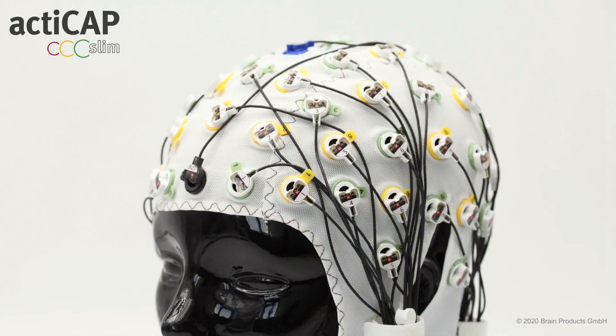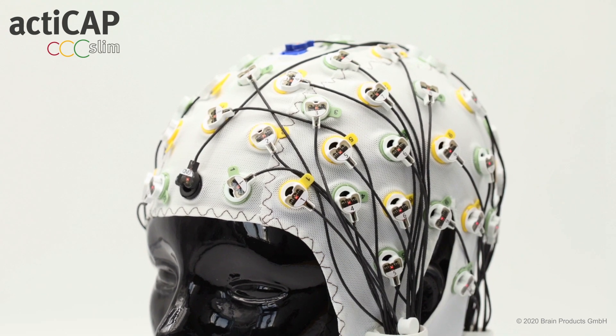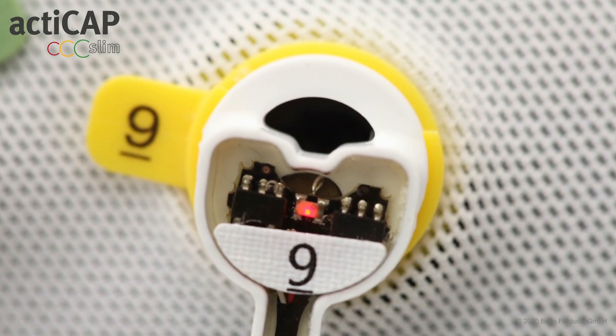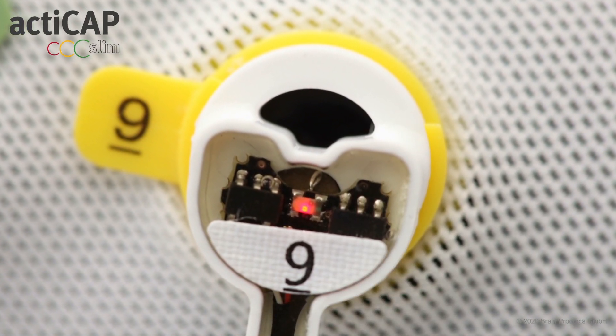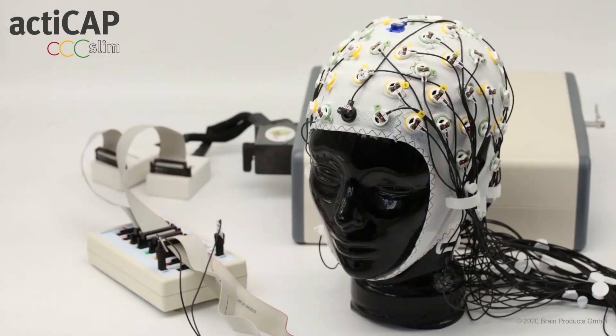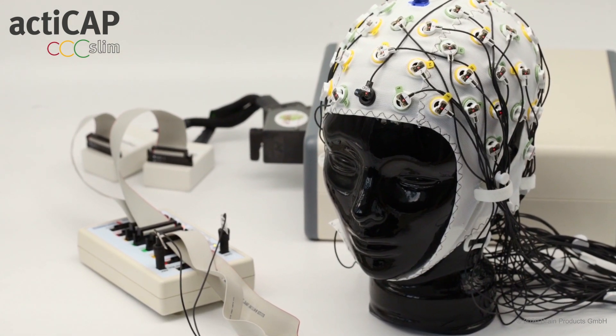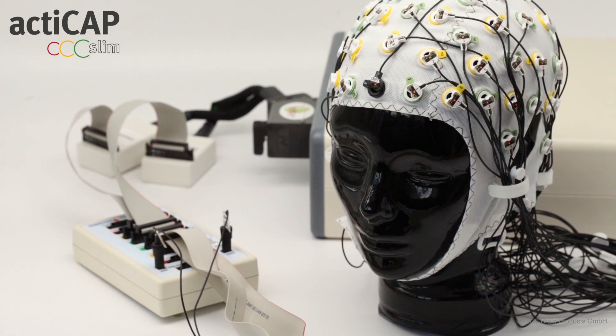Or perhaps you are interested in very long recordings while maintaining high quality data. Hence the ActiCap Slim with active gel-based electrode is best for you. The control box provided with the active electrode system is here connected to the same adapter in the same exact way.